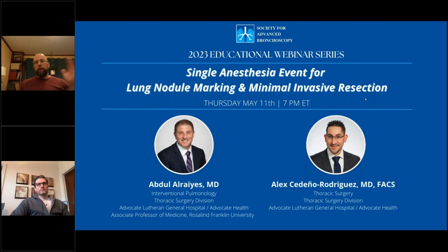Using the RAO, LAO, or that full-on spin is something that we don't do a lot in our training unless you've got specific trainers that have worked with you. You begin to incorporate some of that as you use this technology, and I think it makes you a better peripheral bronchoscopist. Yeah, I completely agree.